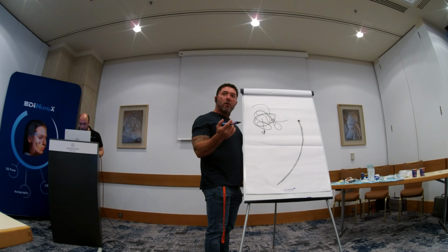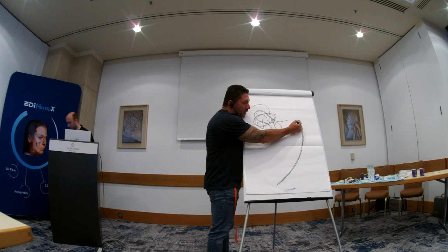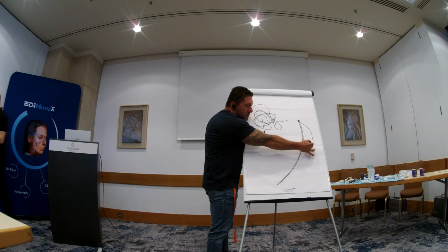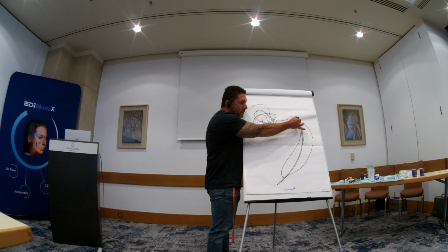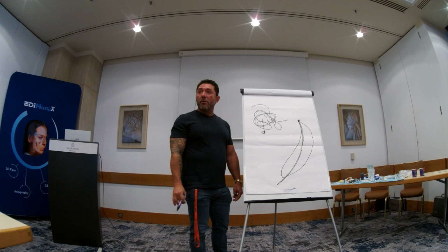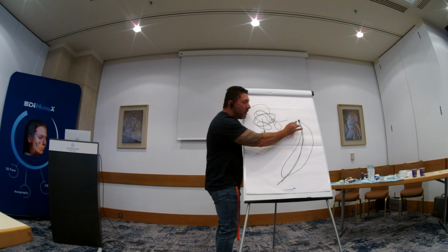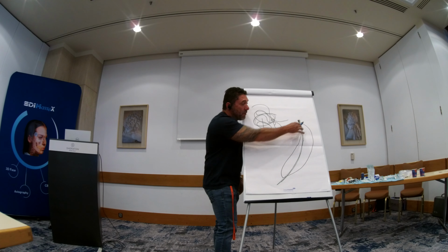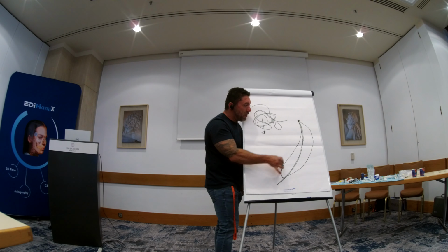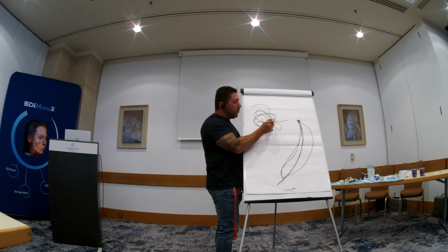Opening and pathways of closing, and that's what helps us make a diagnostic. So we have patients that from the bite, they go out first, and then they come back in. And that, for instance, shows that the jaw is unhappy in the way that it is because they want to get out of the house really quick. But when they're going to come back, they remember that the garage is small and they will come from the inside. And this incongruence will create an incongruence here on the lines as well.